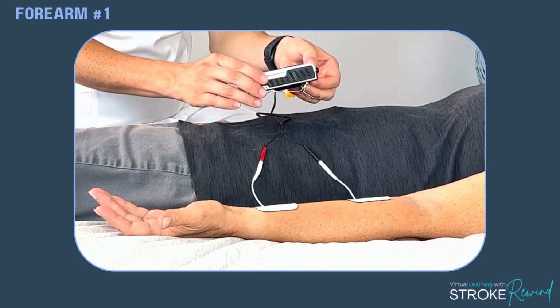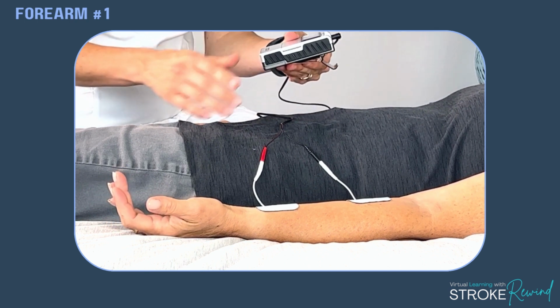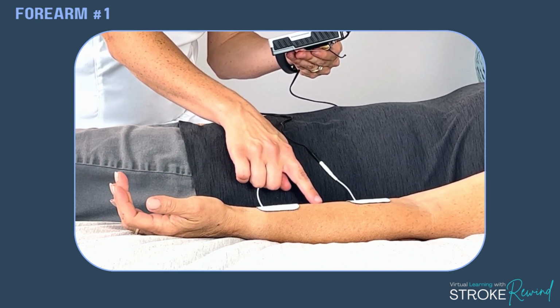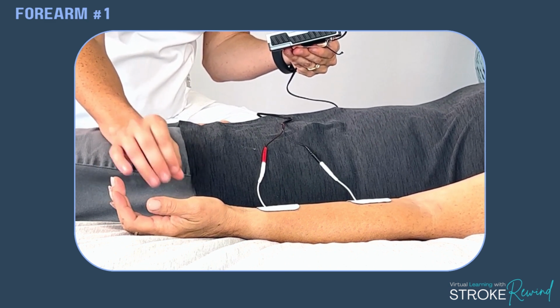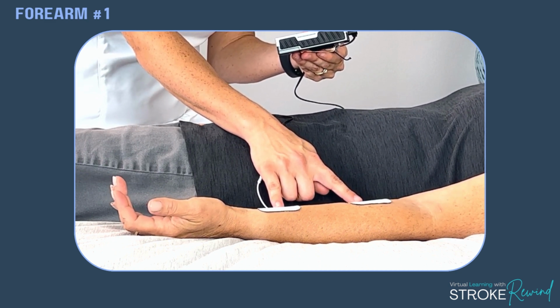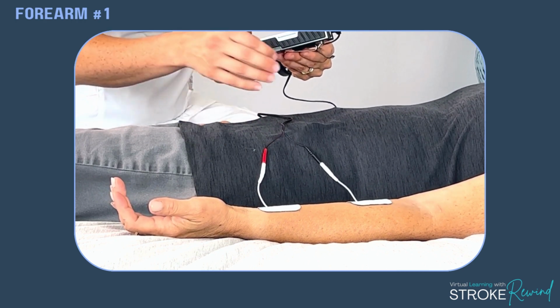I can feel it. Okay, and now we're going to start to get it to move. I'm going to move it up. Oh, you see that? Are you moving your arm? The machine is moving her arm. You can see this movement here. It's reminding the brain, and it's actually moving the fingers at the same time, which is incredible. So it's a good placement for her. So again, 10 to 15 minutes a session. You can do it a couple times a day. Great, great way to remind the brain how that forearm is supposed to be moving.